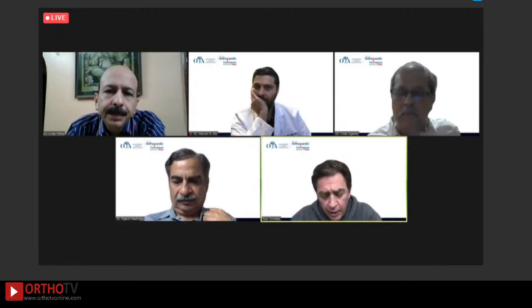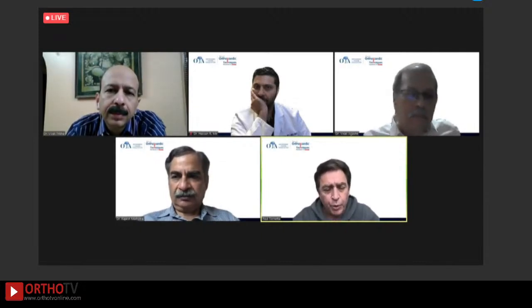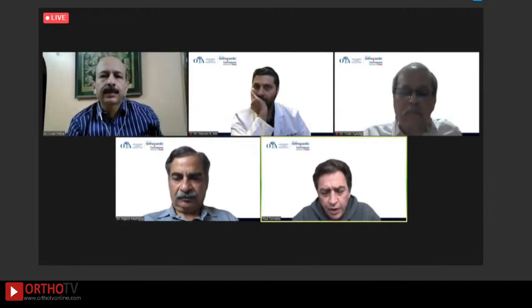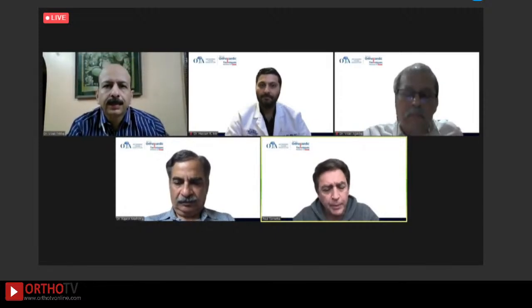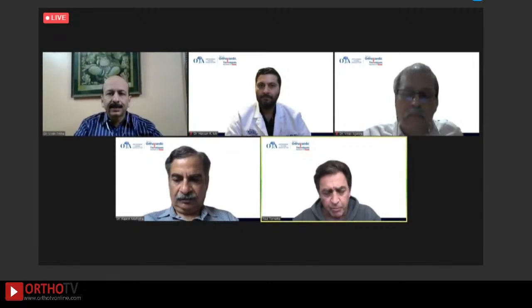I got involved. I'm not with the company or anything, but I got involved because I saw the early data on this, and it was pretty convincing for something that I wouldn't have thought was a great idea. This is for the contralateral hip in patients who have femoral neck or intertrochanteric fractures, of burring out the inside and inserting a phosphate to have it then heal.